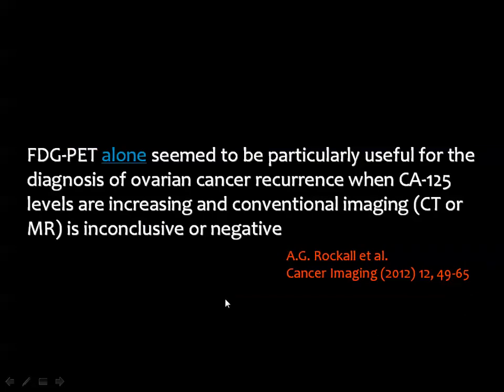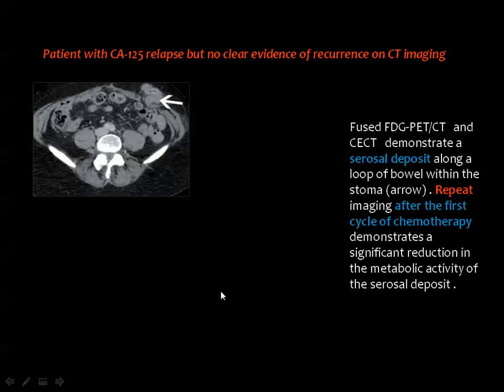And the literature says that PET CT alone seems to be particularly useful for the diagnosis of ovarian cancer recurrence when the tumor markers are increasing and the conventional imaging is inconclusive or negative.